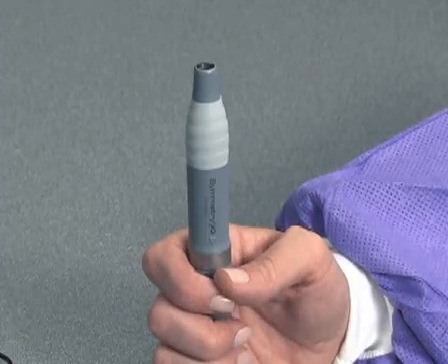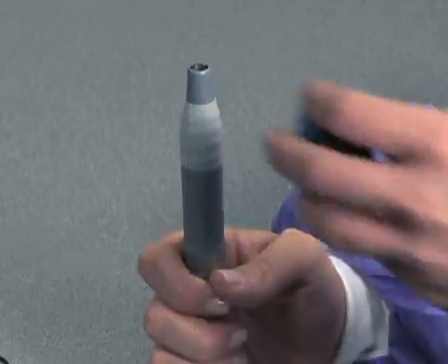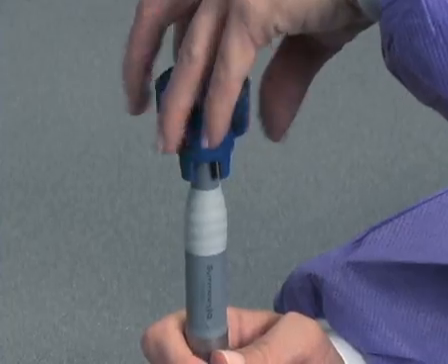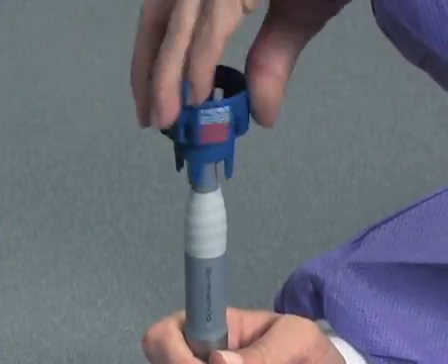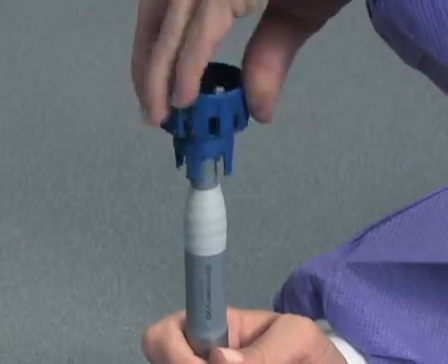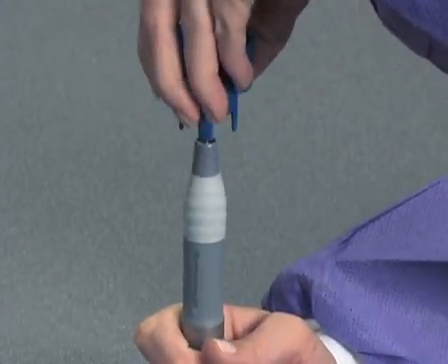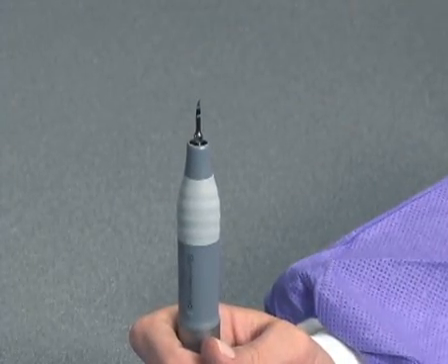Hold the handpiece vertically. Attach the tip to the handpiece using the Guardian wrench by aligning the threaded end of the tip to the handpiece. Depress the wrench slightly as you begin rotating to fully secure the tip to the handpiece. Rotate the Guardian wrench clockwise. When you hear a click, the tip is secured to the handpiece. Remove the Guardian wrench by sliding it over the secured tip. Installation is complete.